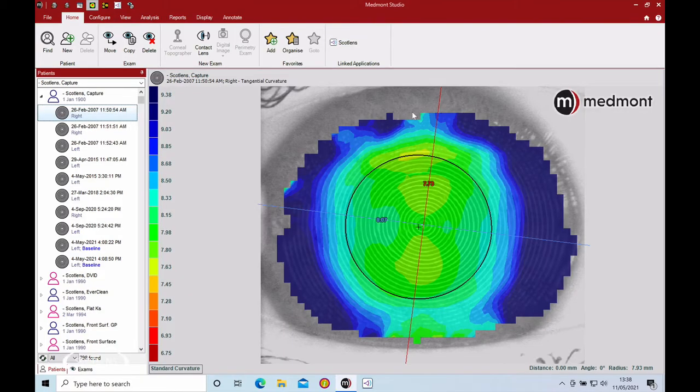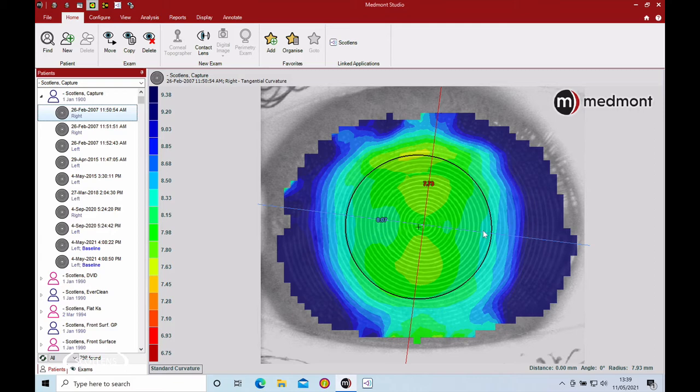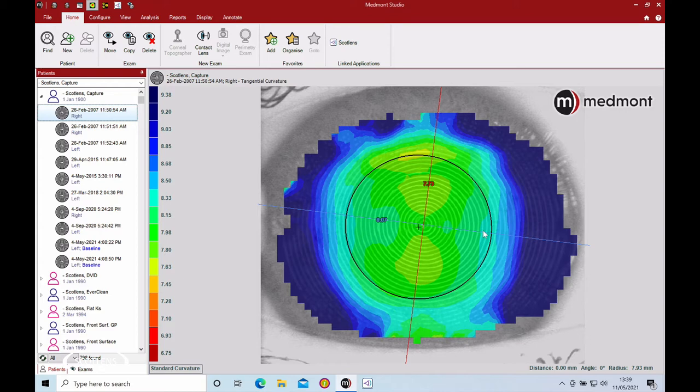Let's talk about capturing good topography. Every topographer is different, but we want to end up with a nice full capture with the patient's eyes wide open and good quality tear film, because it's the tear film that we capture in the topographer, not the actual cornea. There are various ways to improve this with each topography.